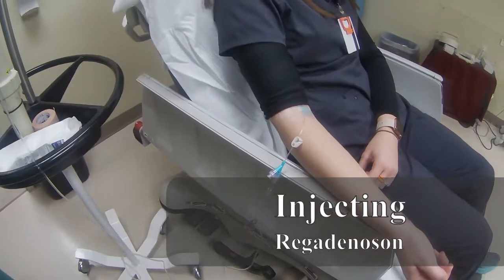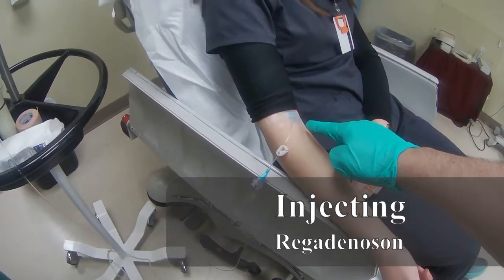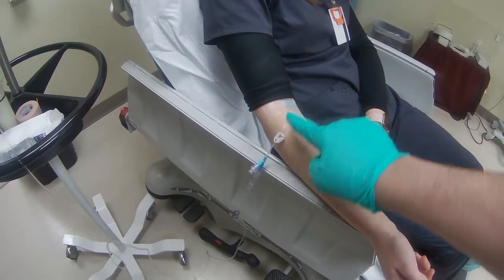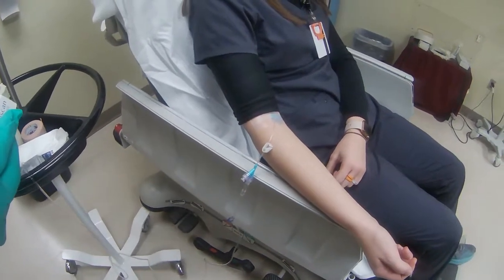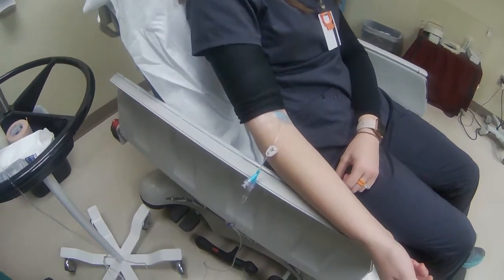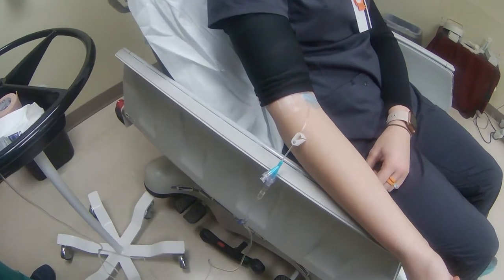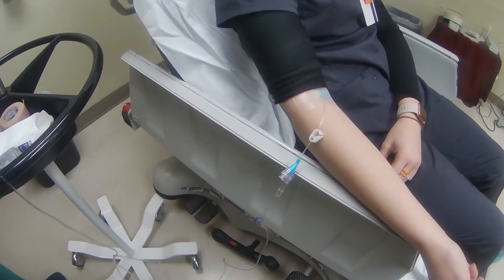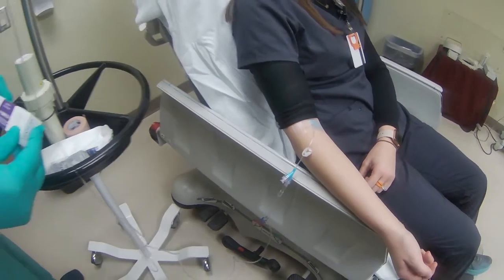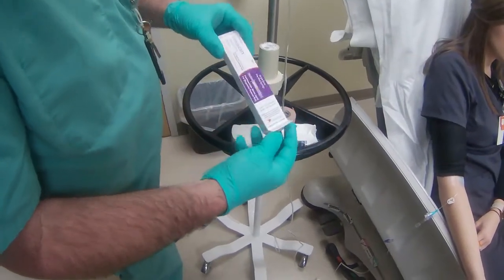And now once your patient is ready, the patient has a cannula and it's connected to a bag of saline. And then your patient should have 12 lead EKG and will be connected. Your technologist will give you the Lexi scan or the regadenosone.